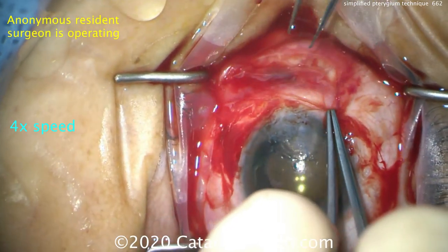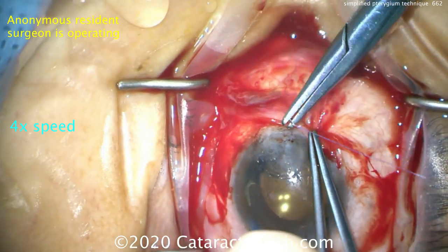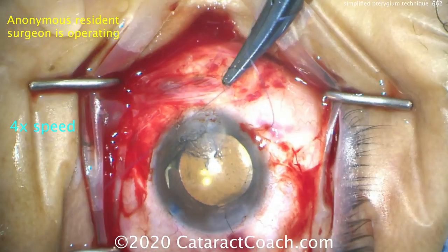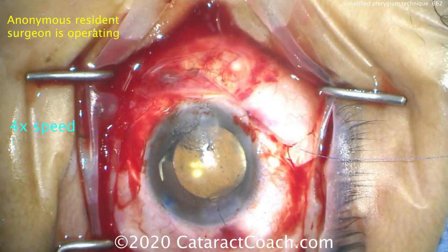And now you have a nice covering here without having to do a free graft — a simple technique. Using some Vicryl sutures, those can be sutured down into position. Here you want to go conjunctiva, a little bit of sclera, and then back to the conjunctiva, then tie this up and it'll place that conjunctiva exactly where you want it.